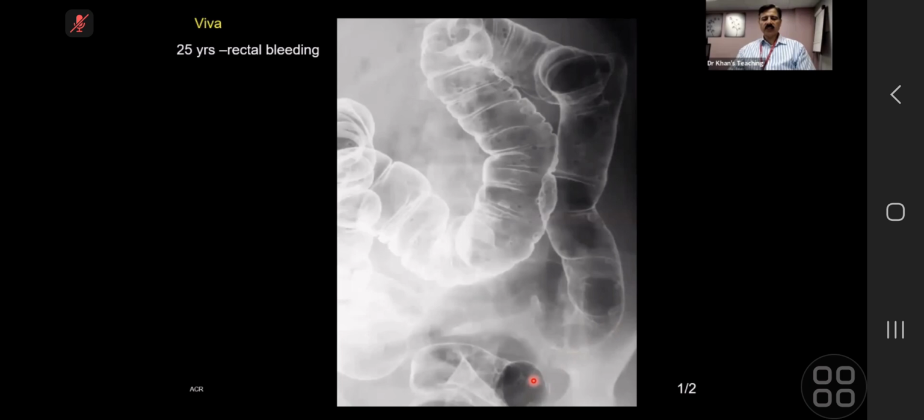And so this is a barium enema. You said a follow through. Maybe you meant an enema, right? So yes. Now you have picked up polyps. What are you going to advise? What is your diagnosis and what are you going to advise?